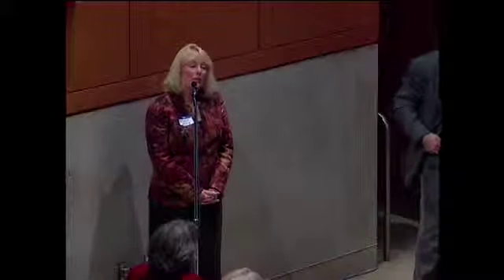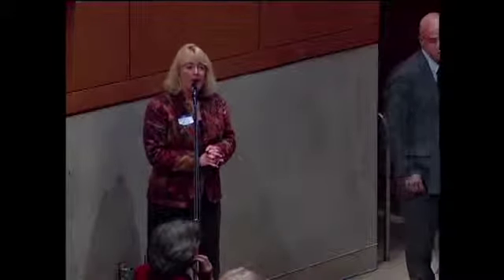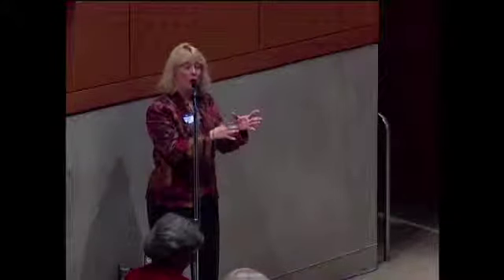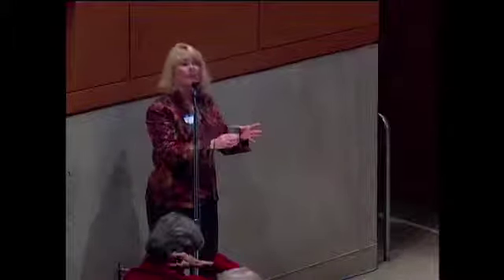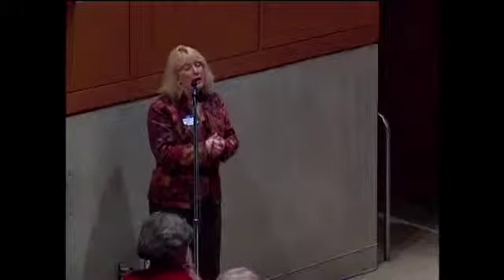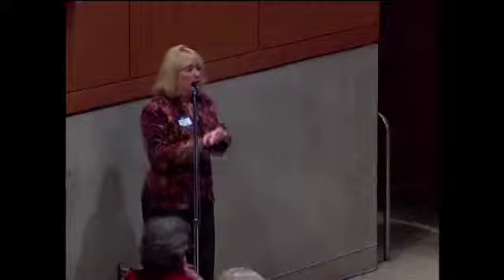Right. I think it's a very important question, and I'm sorry I don't have the greatest answers for it. For trying out the machines, the one thing I would say is it's important that you do it as quickly as possible. Because once your machine converts to a purchase, it's going to be very difficult for you to try other machines. The ideal would be you try as many as you can before you commit to one, and then try that one, and as early as possible, within the first few months, is when you want to be asking to try the other machines. Now, you're also eligible for a new machine. I think it's every 4 years. 5 years. But that's a long time to wait on the wrong machine. So I urge you to make sure that you're asking all your questions up front and ask to see the other equipment that's available. Yes, Diana had a comment?